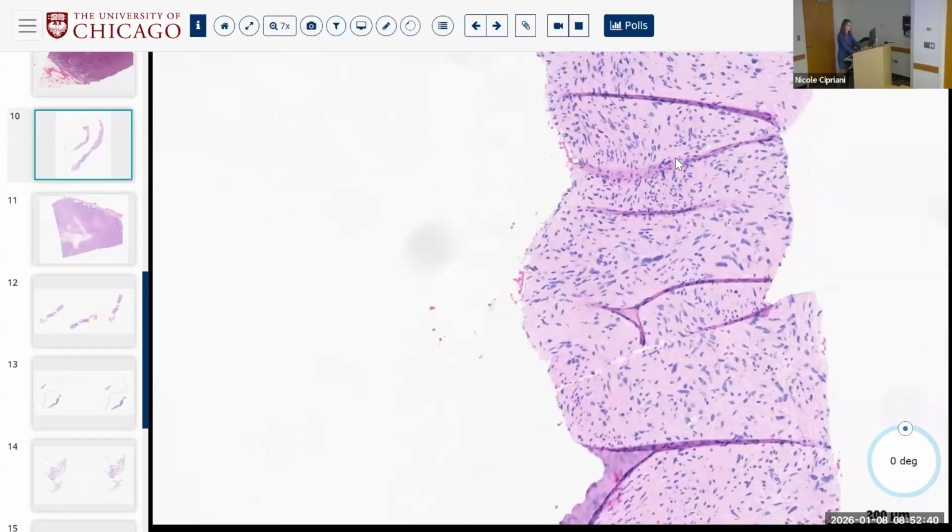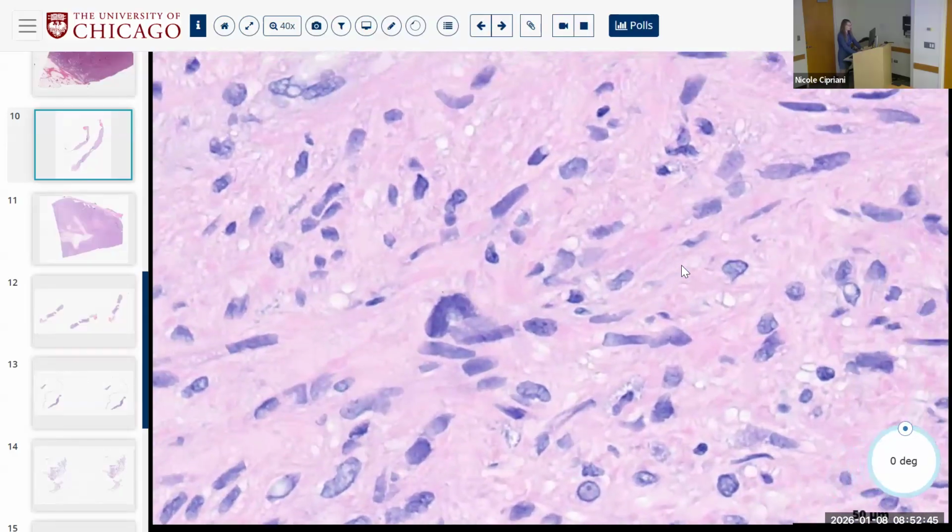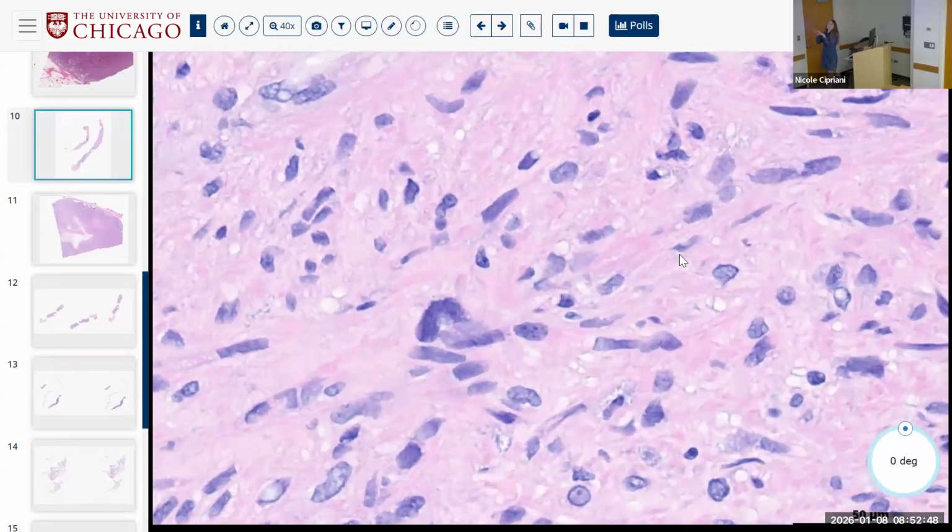I know this is a scanned slide and maybe those characteristics are less prominent, but even in areas like this, you can see a colorimetric shift in the pink, where there's a really dense pink coming out of the nuclei and a paler pink in the background. So that to me is good evidence that this stuff next to the nucleus is probably true intracytoplasmic, more brightly eosinophilic myofilament, which means it is myoid or smooth muscular, right? I know that it's subtle, but hopefully you can make that out.